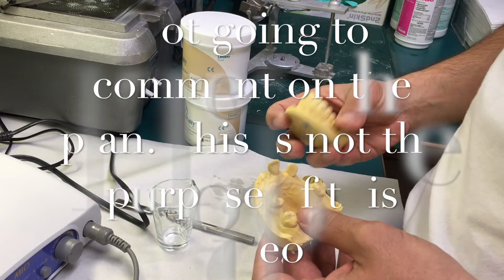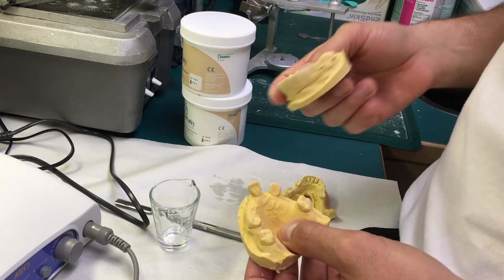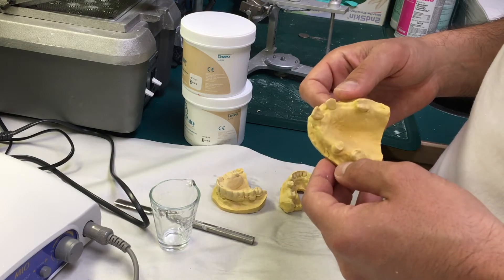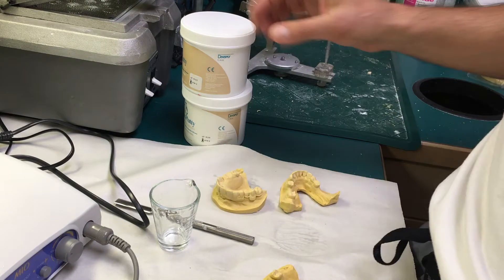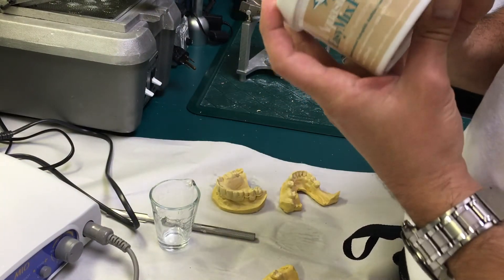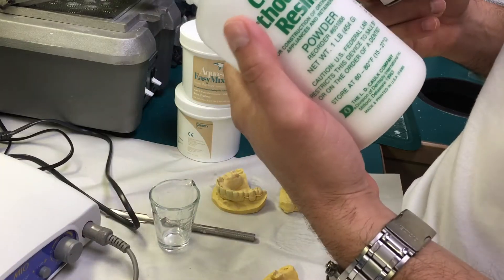In a common situation, this is the patient's cast with the existing RPD and we're going to use this. I'll show you an inexpensive way on how to proceed. What I have here is some petroleum jelly, a silicone putty — this particular one is the Aquasil — and I also have monomer and powder.